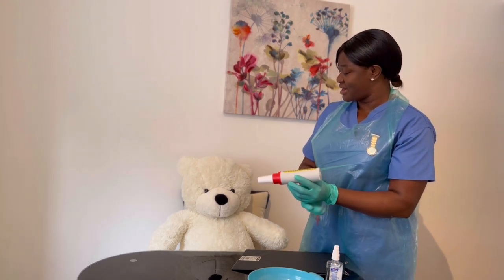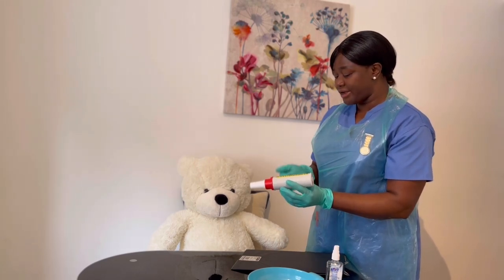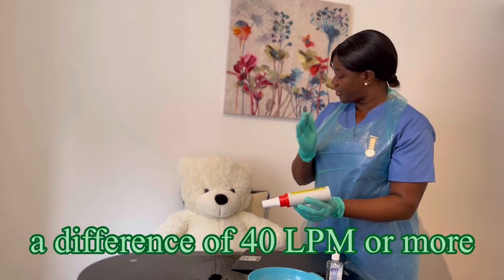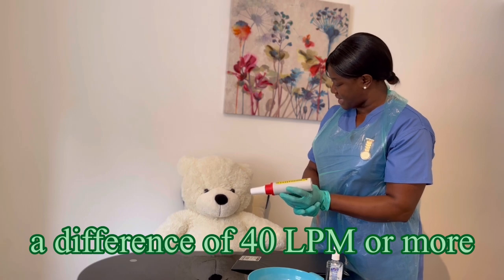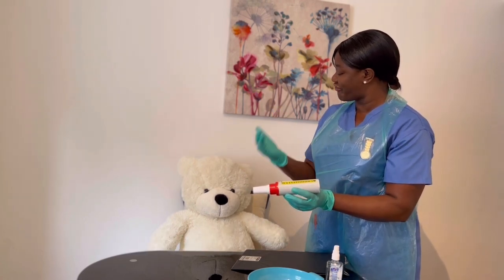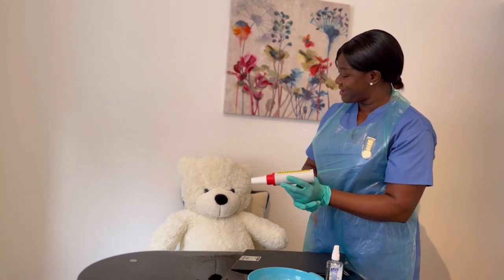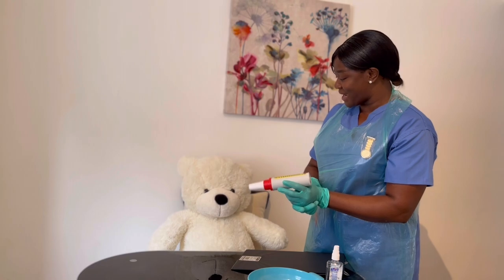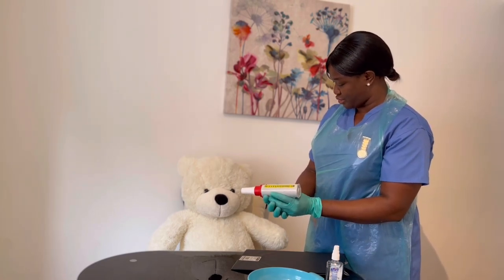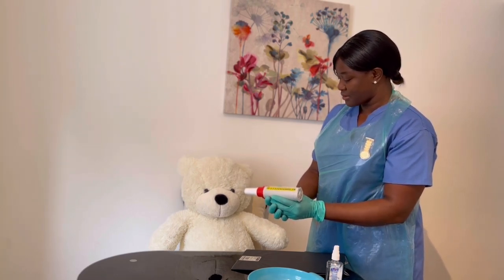We're going to take the best peak flow among those three readings — the highest will be your best peak flow. And if there is a difference between your three readings of 40 liters per minute, you're going to repeat two more to make a total of five readings, and you take the best reading from those five. So are you ready to have it done? Yes, nurse.